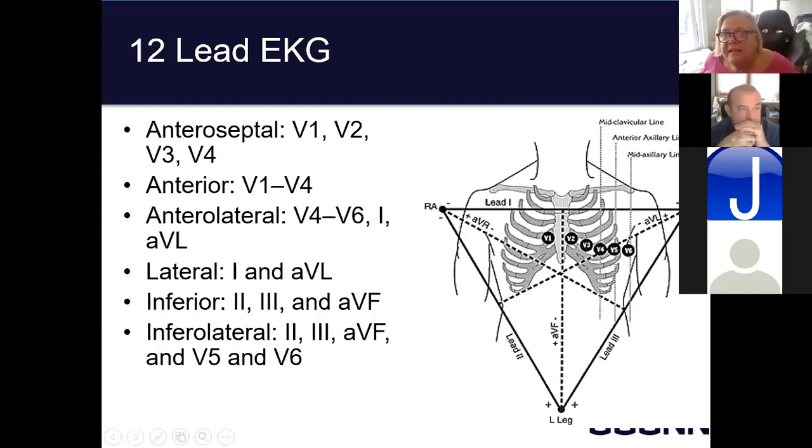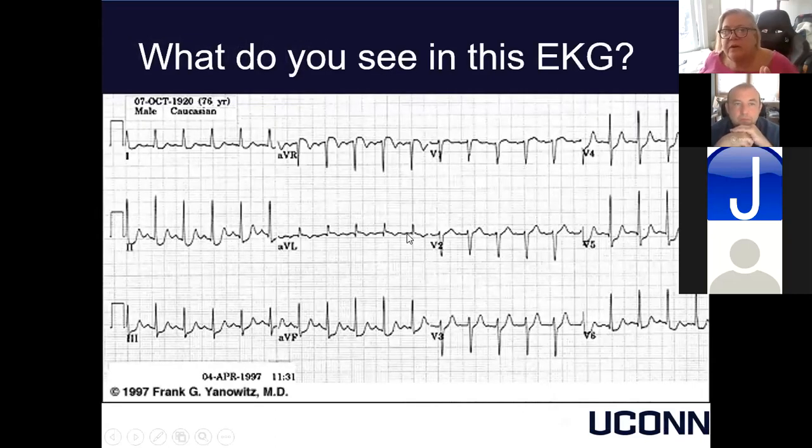And what these 10 leads measure are 12 different views of the electrical conductivity through the heart. Those 10 leads show these 12 different views of conduction through the myocardium.